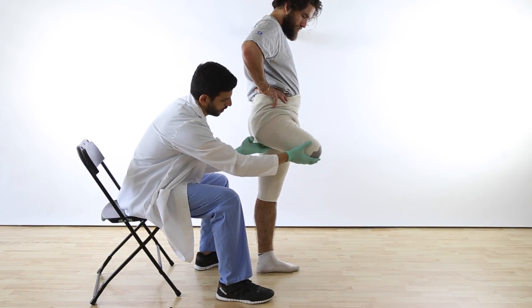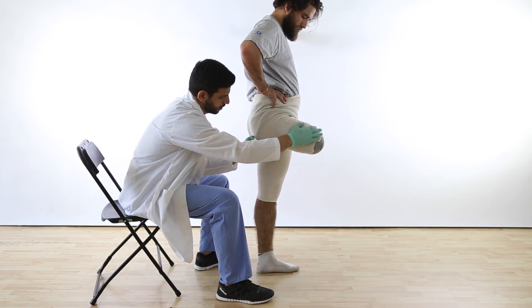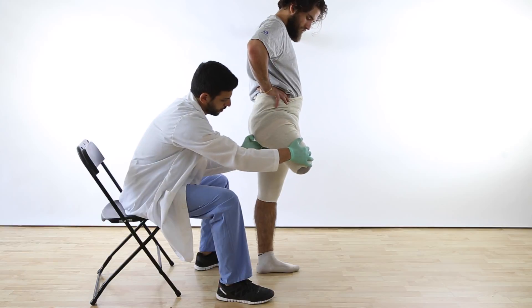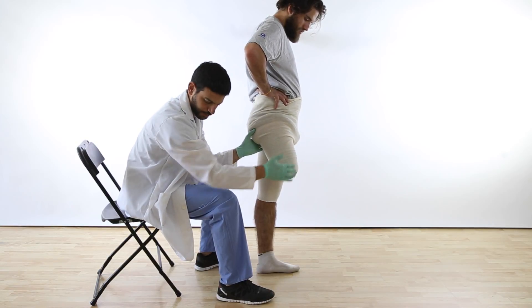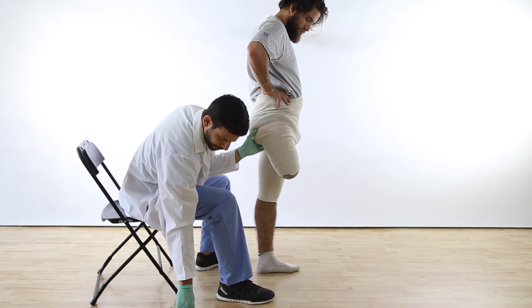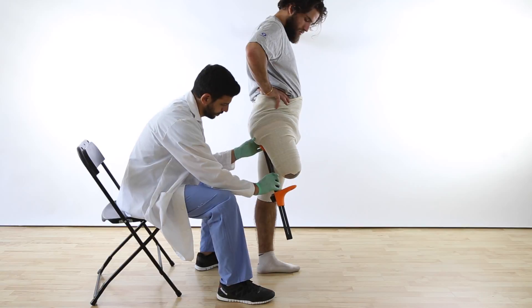Before placing the limb capture tool on the patient's limb, locate the ischium through palpation. Once located, maintain that position with your hand and bring the limb capture tool to sit right under the ischium.